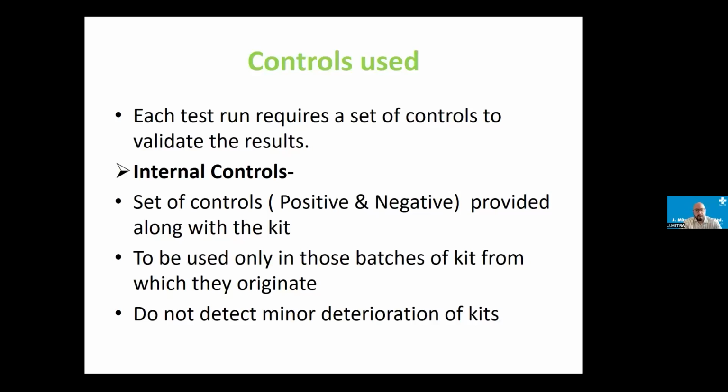That's it. So one last question. Circling back to that old question about positivity. You said that if a system had given a positive result on CLIA, you would discard the sample. But if you're working in a laboratory where you had a CLIA positive but a NAT negative for whatever reasons, how would you approach that sample? Would you discard that sample, or would you have it retested in NAT or ELISA? What would be your approach, sir?